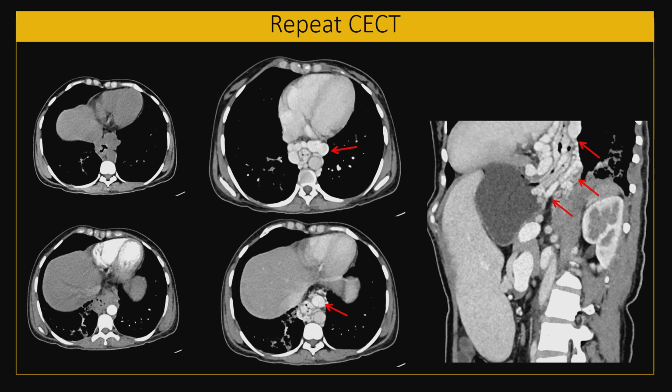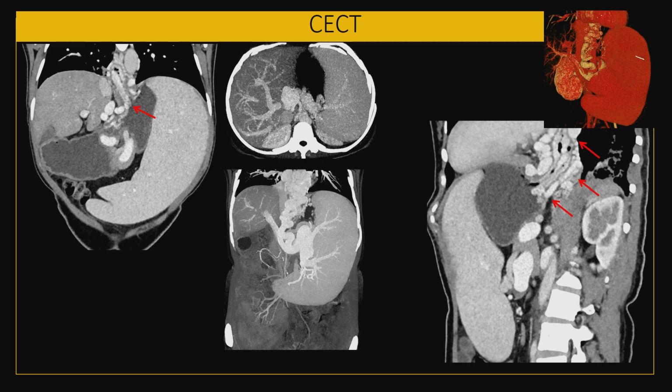The patient was referred for an esophageal mass biopsy, which was not done later, and she was treated for these esophageal varices. So here you can see the same case, multiple gastric as well as esophageal varices. And when we look at the liver, what do we see? There is enlargement of the portal vein, particularly the central part of the portal vein, but the peripheral pruning of portal vessels is there. So this is quite typical of non-cirrhotic portal fibrosis.